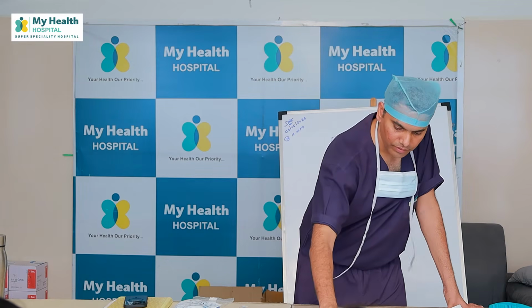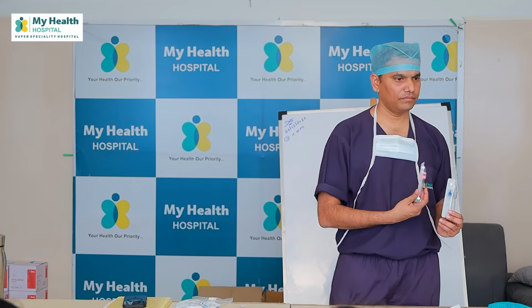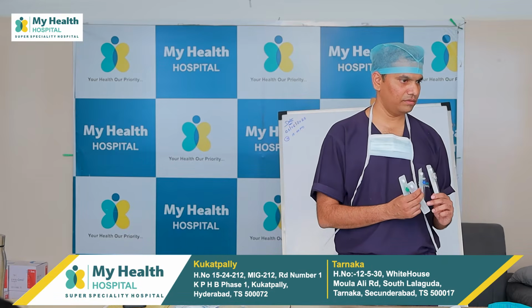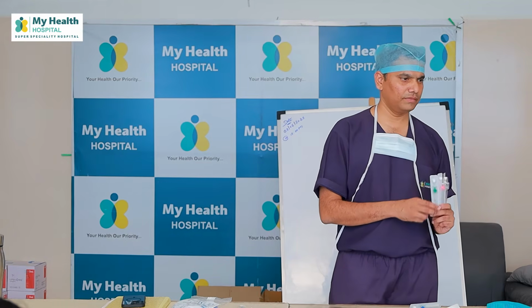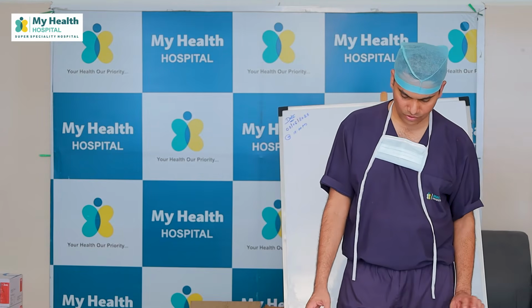Next, what else do we have? Let's take the cannula. Identify the size based on color. Blue. Okay, done. What else? 18. Very good. Awesome.